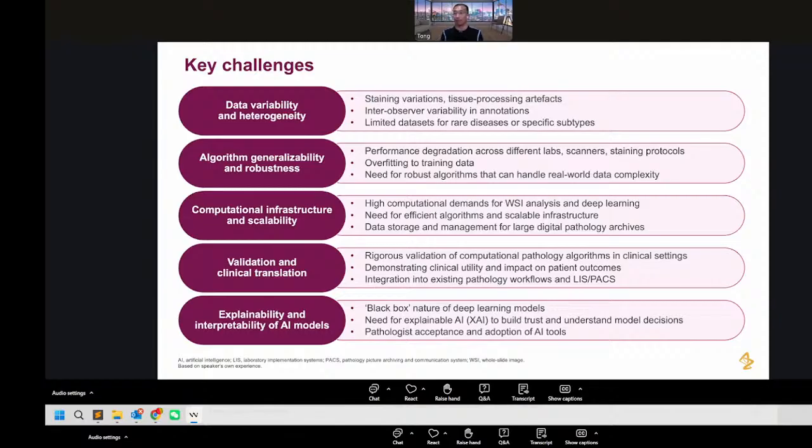Some academic centers are probably not that sensitive to cost because they have research funding and other funding resources to support them. But community-based hospitals are very sensitive to cost. If they cannot get reimbursed, why would they invest this much for nothing?